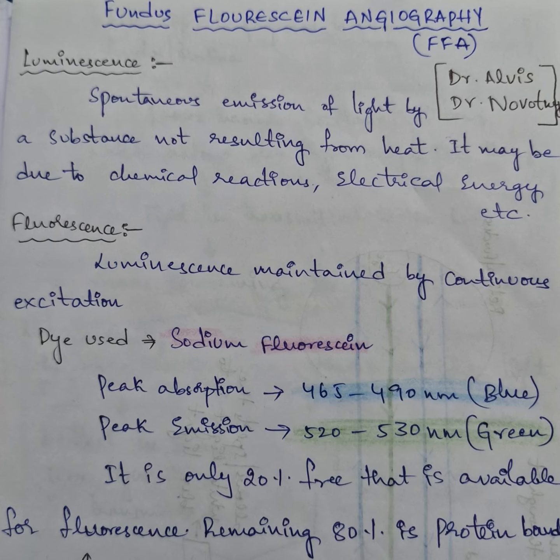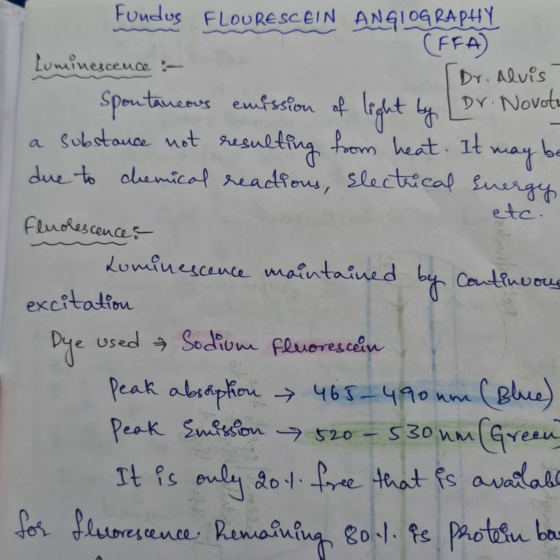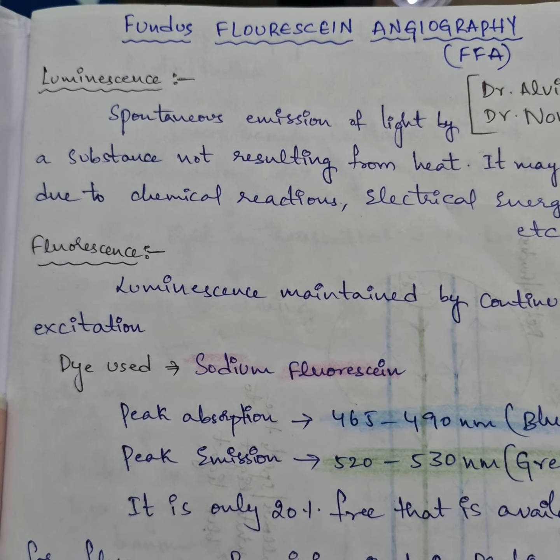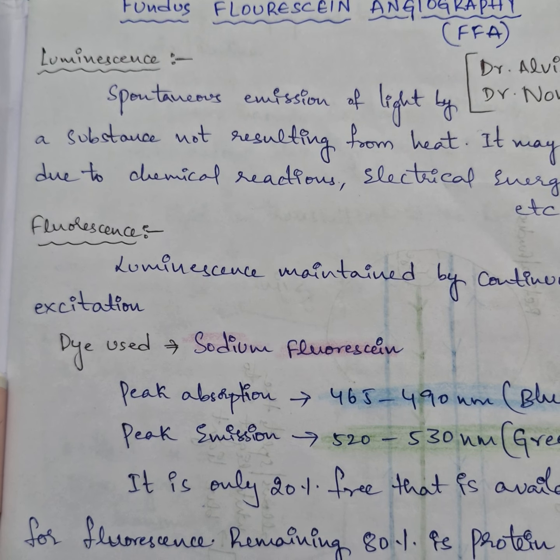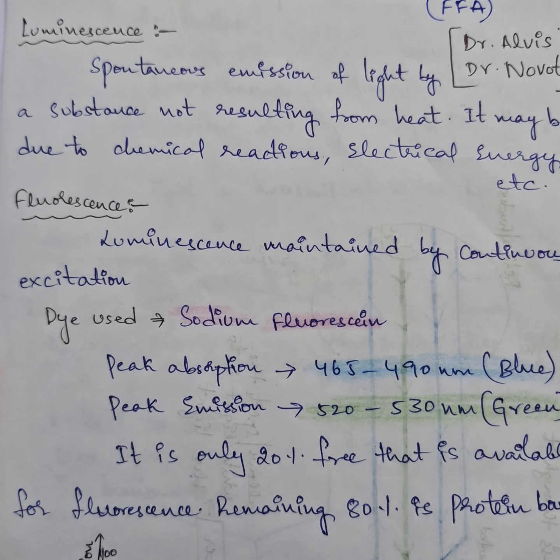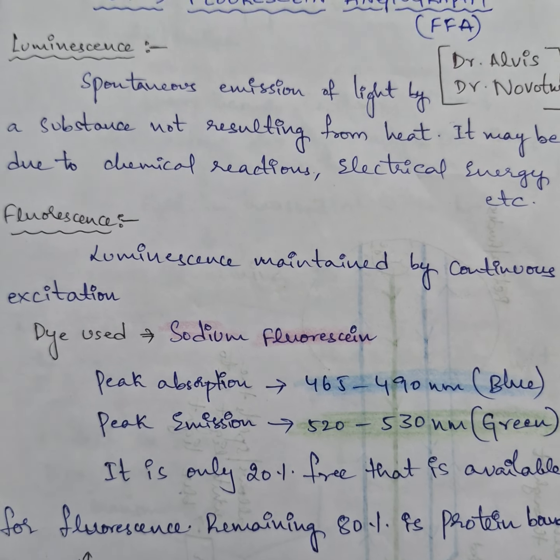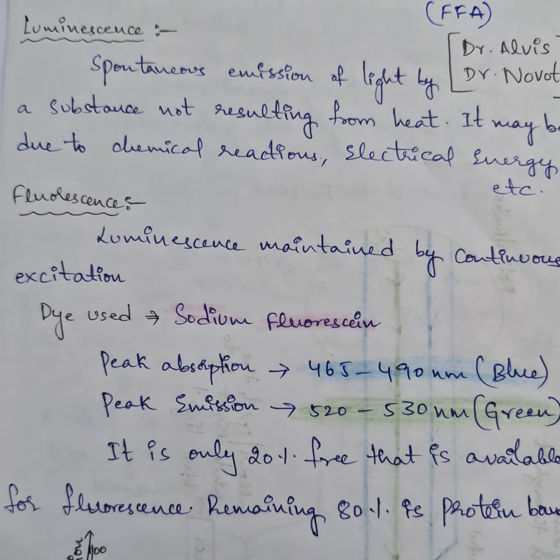So today we'll see a very interesting and important topic called fundus fluorescein angiography, FFA. We have to know certain terms like fluorescence and luminescence. Luminescence means spontaneous emission of light by a substance that is not resulting from heat, maybe due to chemical reactions or electrical energy. Fluorescence is that luminescence which is maintained by continuous excitation.